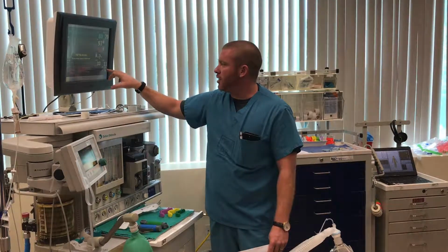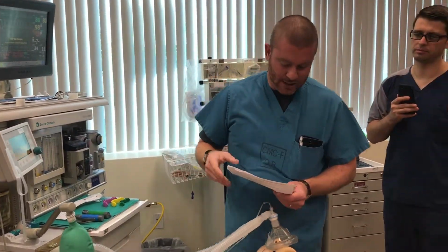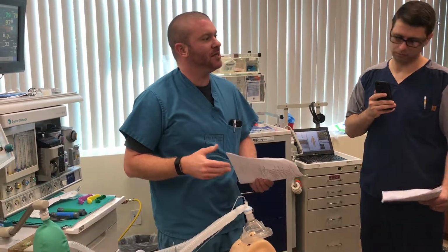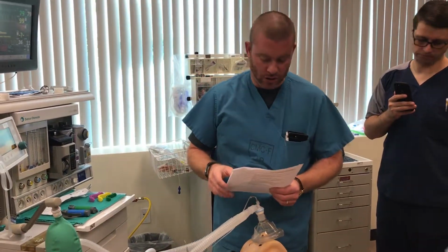So I'm getting all those on. Now, when you see me here, all of my monitors, I've placed those on. Precordial stethoscope connected to earpiece. We would have one of those if we needed. I'm going to take that out for you guys right now until we get to pediatrics, okay? You don't need that one.